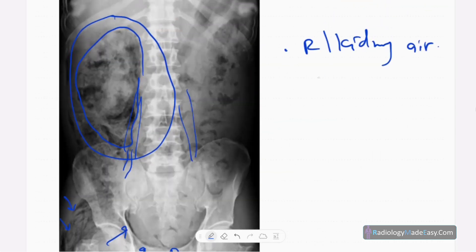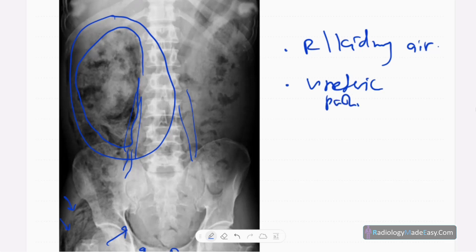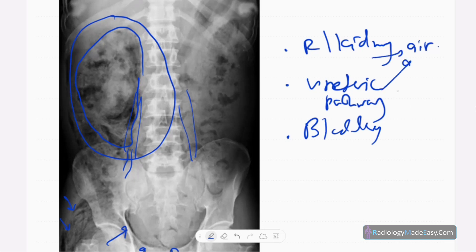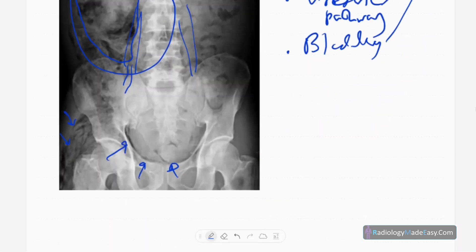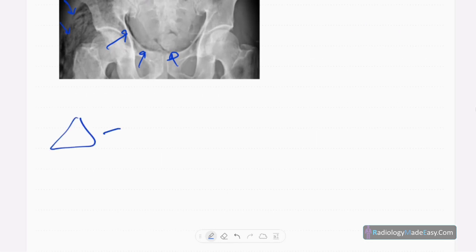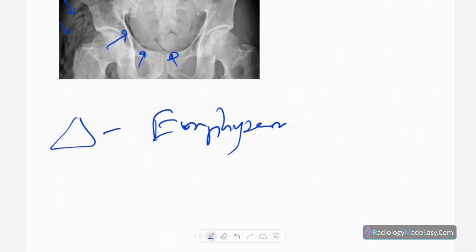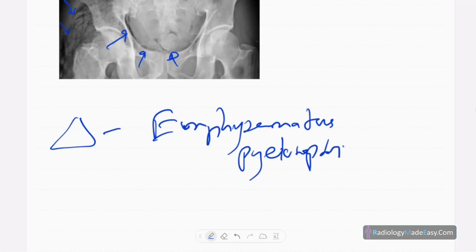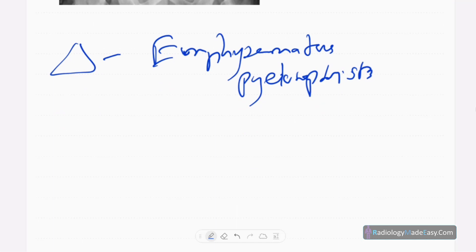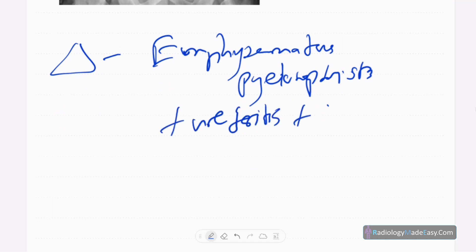In this case there is air in the kidney, ureteric path, and also in the bladder — you can see it in all three areas. So the diagnosis is emphysematous pyelonephritis. You can add emphysematous ureteritis plus emphysematous cystitis also — emphysematous pyelonephritis complicated by emphysematous ureteritis and emphysematous cystitis.